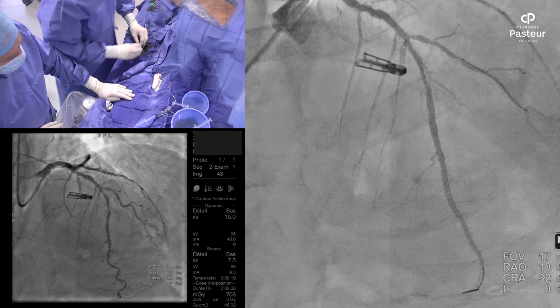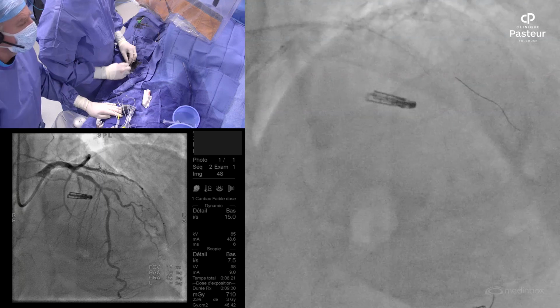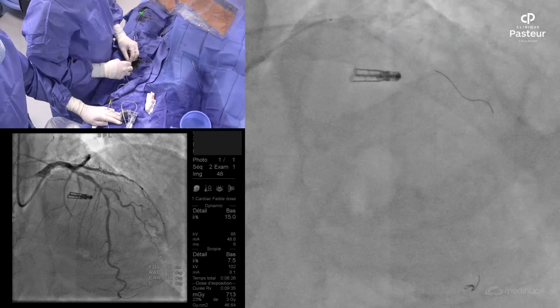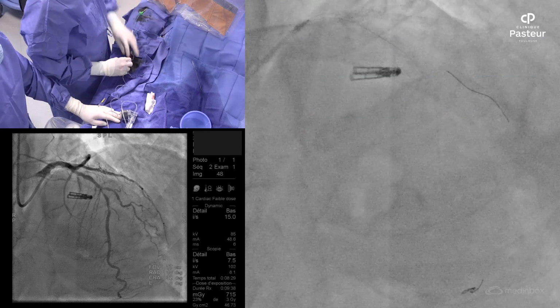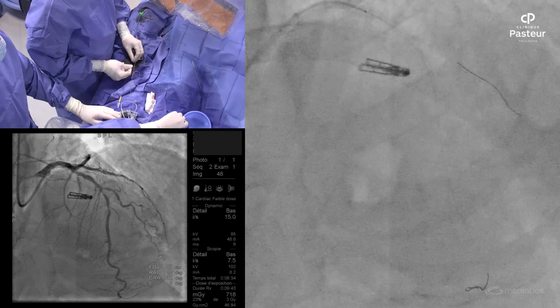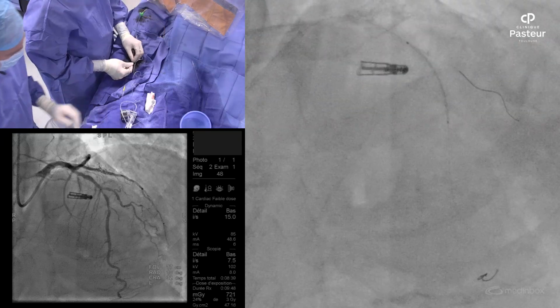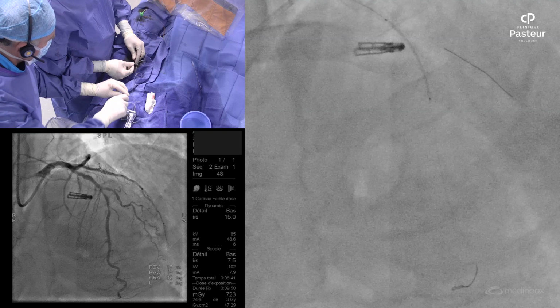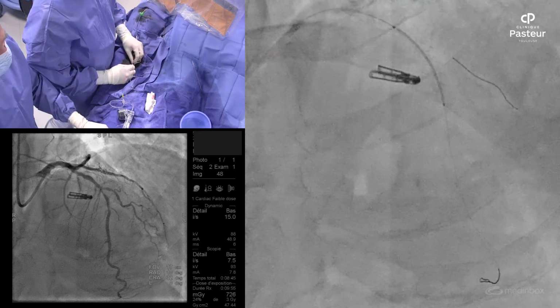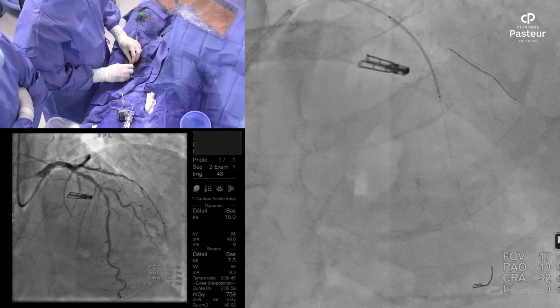Okay. Just to cover that outflow disease, which otherwise you'll be into. And also because we will do a POT, we need at least 10 millimeters before the bifurcation. So 34 could be a good option. So we go for 34 millimeters length, 3 millimeters diameter as your advice, and I think it will be the good length to cover all the plaques, especially on the mid LAD. Let's see, maybe we have to go down. I think 34, yeah, it's okay. That's correct, 34.